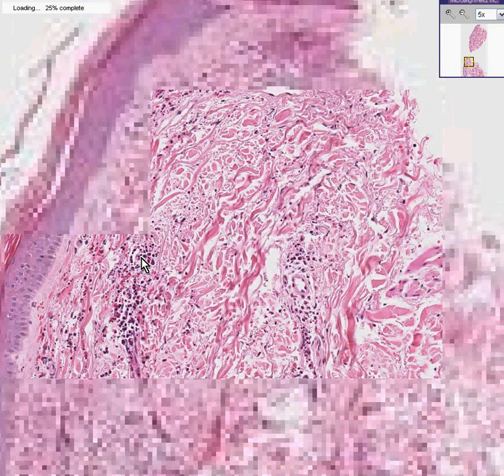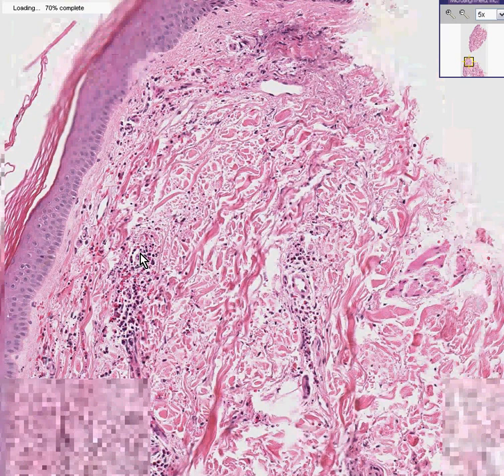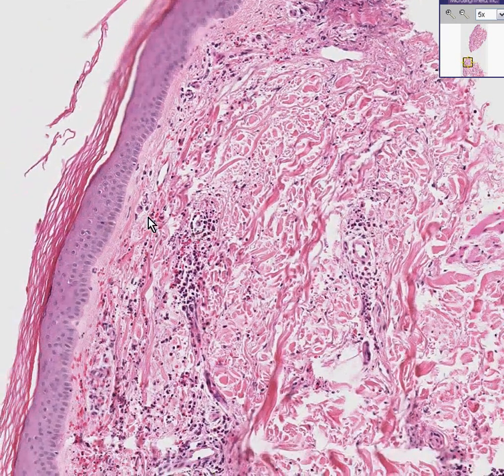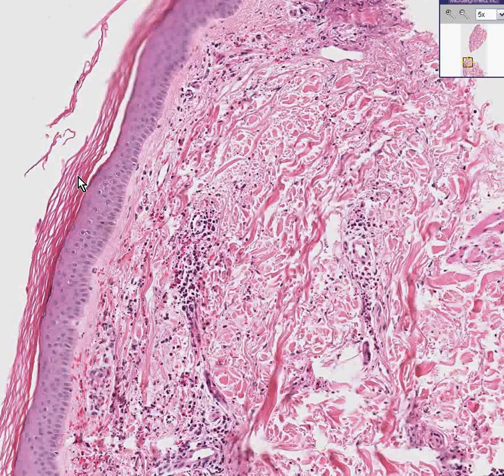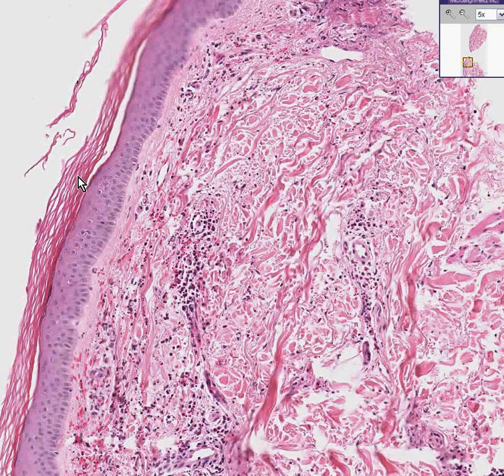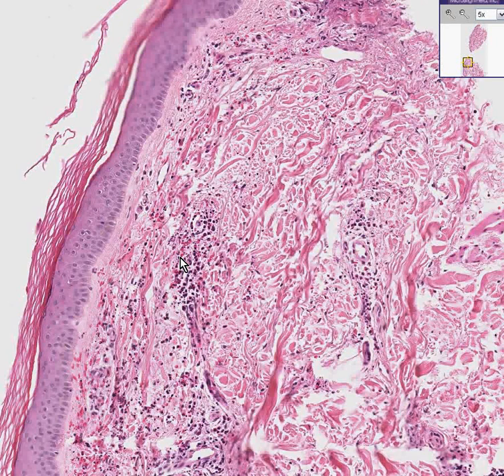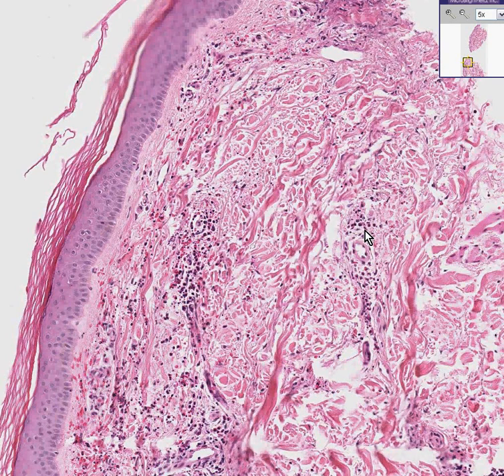This is a particular type of vasculitis of the skin called leukocytoclastic vasculitis. Leukocytoclastic vasculitis means the inflammatory cells are broken — they're clastic, they're cleaved, they're chopped up, they're fragmented. That's why a lot of these infiltrates look much smaller than a cell: they are fragments of nuclei. Notice that the inflammation is chiefly perivascular, around this blood vessel and around this blood vessel, although inflammatory cells are also scattered throughout other portions of the dermis.